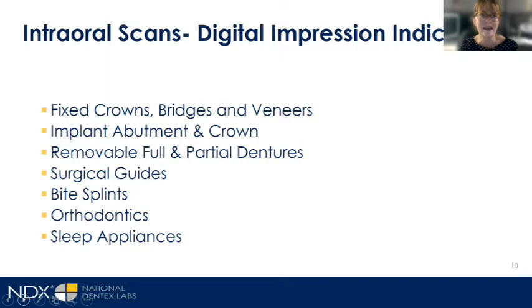But anything that you take a PVS impression for today, you could also take an intraoral scan or digital impression of now. The only one I personally am a little iffy on are inlays and onlays. There needs to be a definitive finish line cut into that preparation that is replicated in the digital impression and therefore the model that is formulated from it, the digital model. And if that finish line isn't there, then it can make inlays and onlays a little tricky.